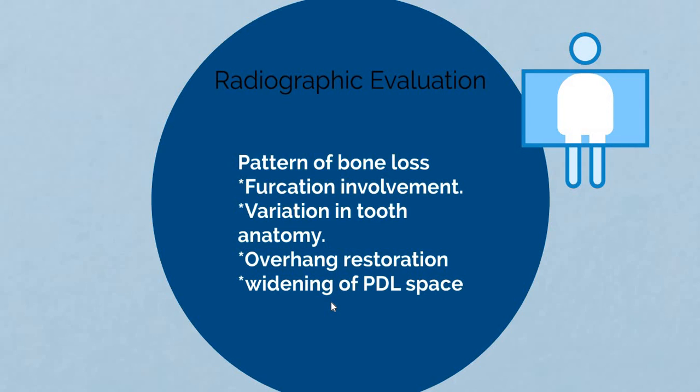So, when you see a bone loss on the radiograph, don't think that this is an active disease. The bone loss cannot happen within a day and night. It's an indication of previous disease activity, not the current disease activity. And these are regarding the evaluation.